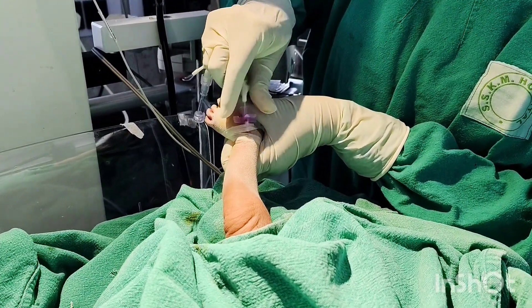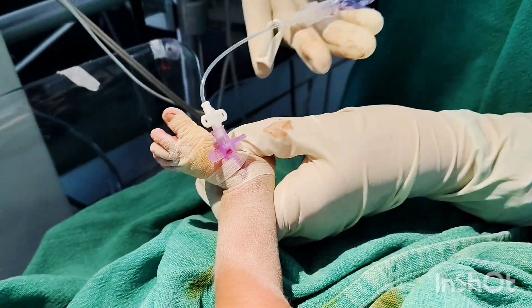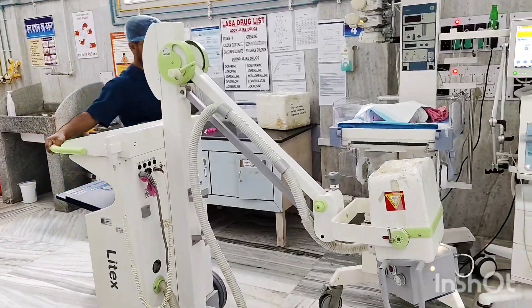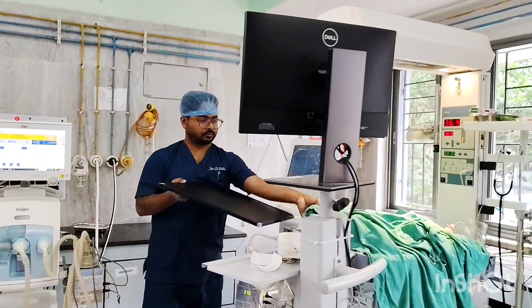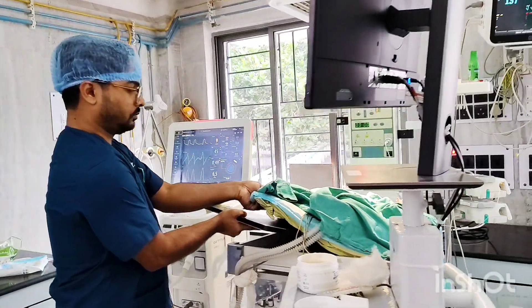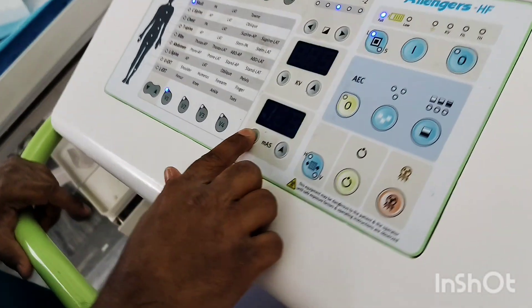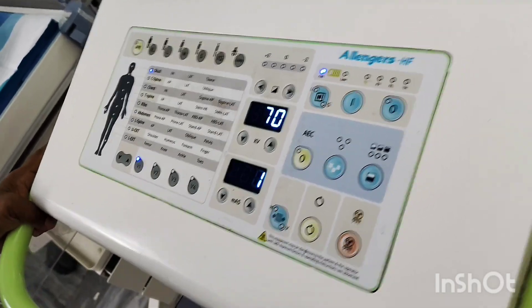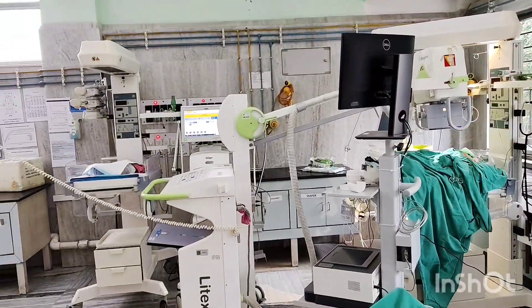The tip of the PICC line should ideally be at high IVC level, that is T9 to T11 level. Position must be confirmed by X-ray or ultrasound, and a follow-up X-ray should be done within 12 to 24 hours. We will confirm the position of the PICC line by doing an X-ray.